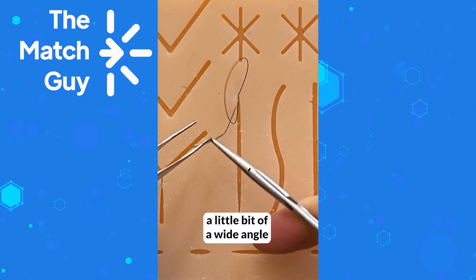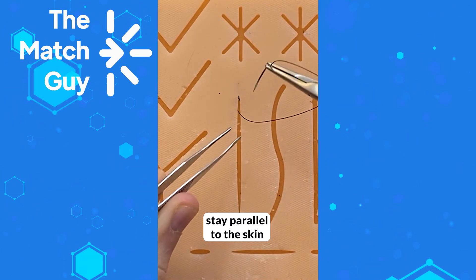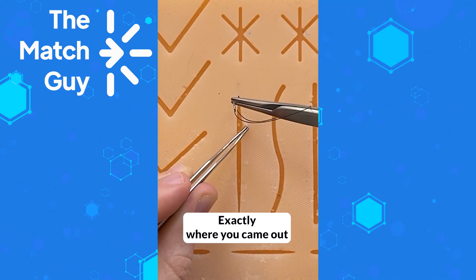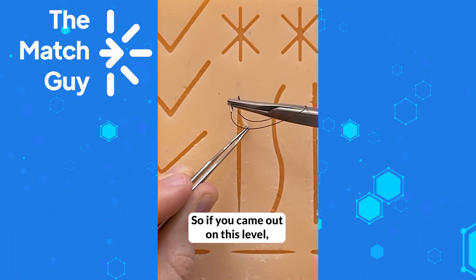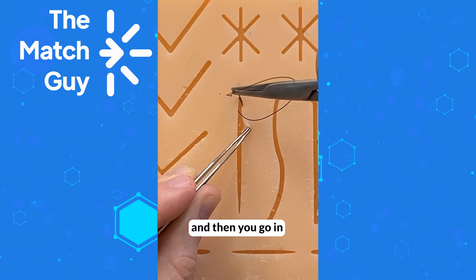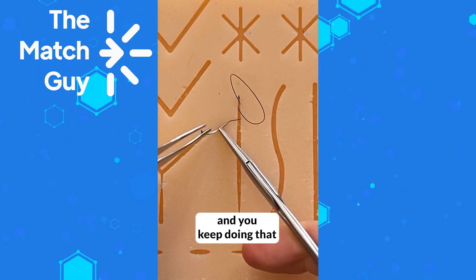Stay in the same level and then come out. Load your needle with a slightly wide angle, then pull. Now go to the other side — do the same thing: go in, stay parallel to the skin, and lift the skin first beyond where you want to come out. Where do you come in on this side? Exactly where you came out, or slightly behind that. So you can come slightly behind that point, then go in parallel to the skin, come out, and make sure you take the same thickness.